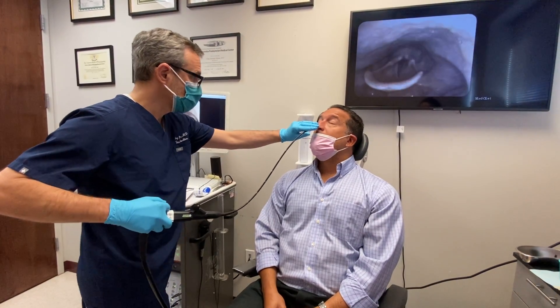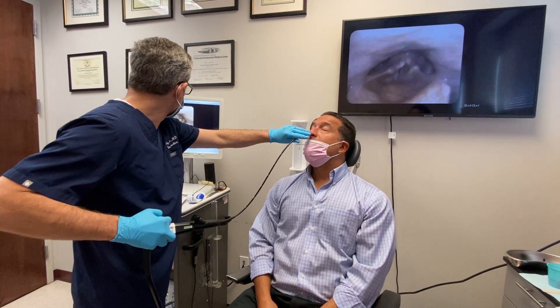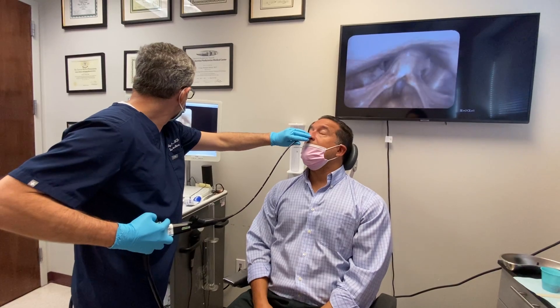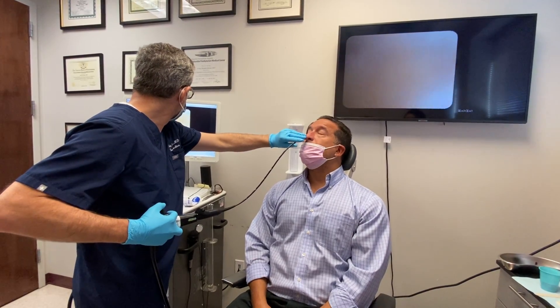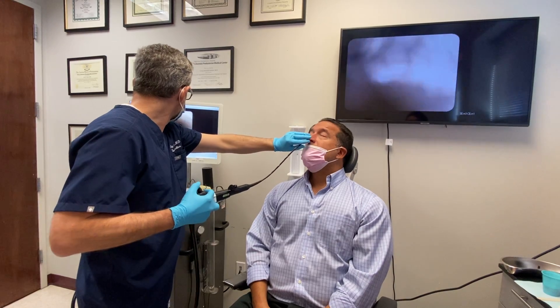Perfect. So now what I want you to do is say 'ee,' and then I'm going to tell you to swallow. You'll feel the camera go in. Say 'ee,' and now swallow. Perfect. Keep breathing — just breathe in and out through the nose.